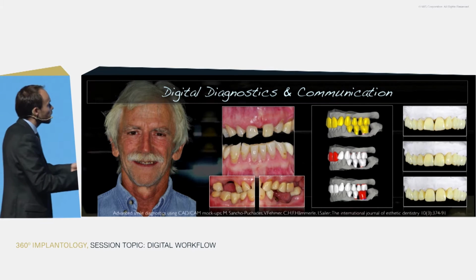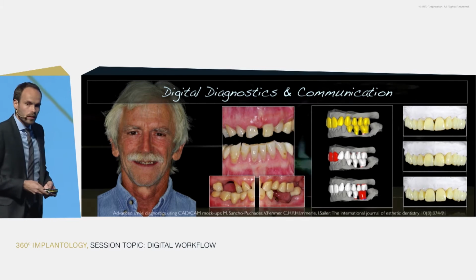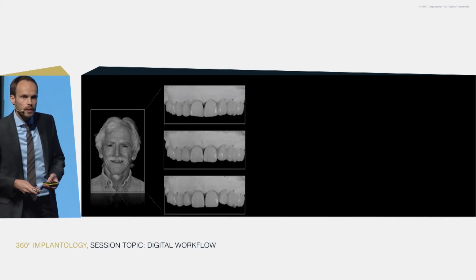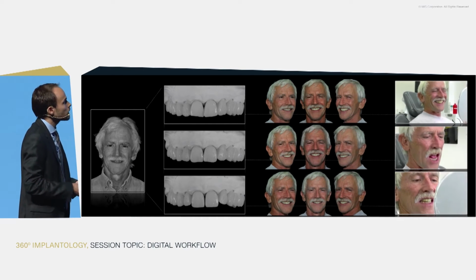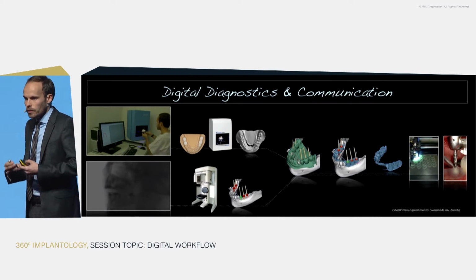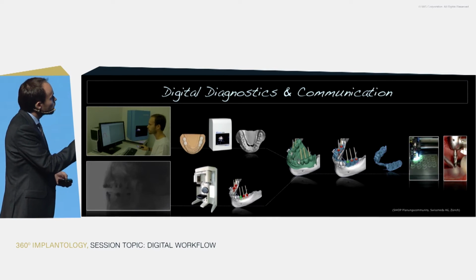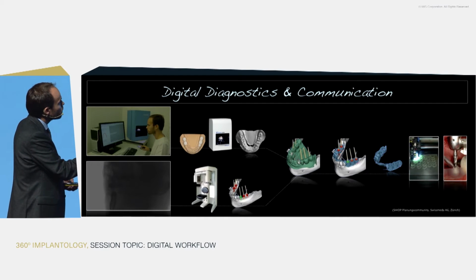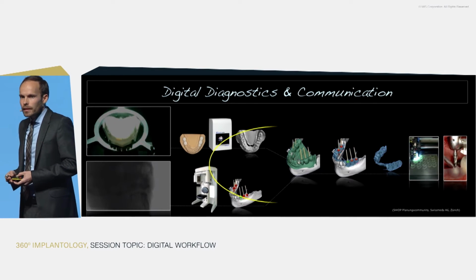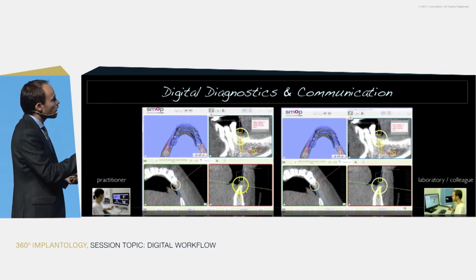But what happens if we go one step further and we try to utilize implant reconstruction in our workflow? Here basically the same thing happens. We do the same protocol as we try in these complex cases. The patient had the chance to choose between the outer surface and the new design of his teeth, and then using this information, using the digital approach with the cone beam technology, the surface scans of the technicians, and understanding the position, understanding the need and the way to place the implants according to the software.